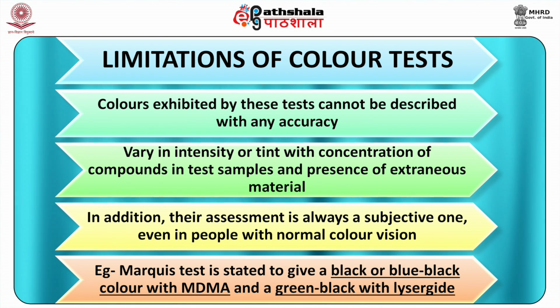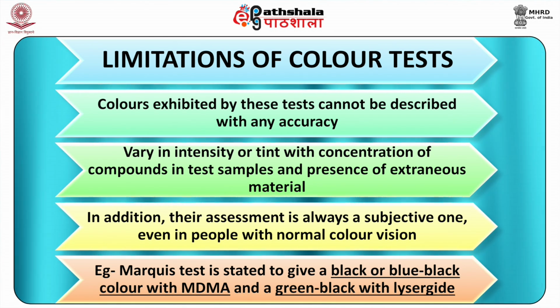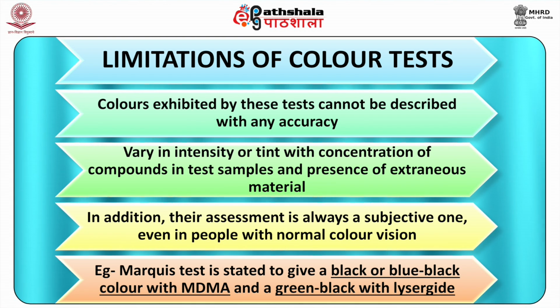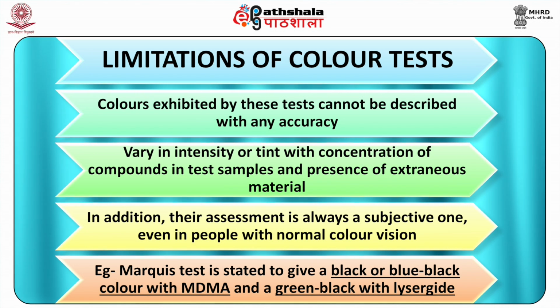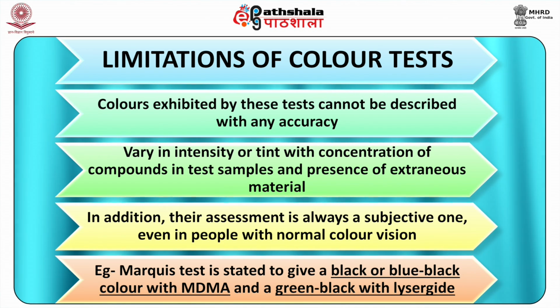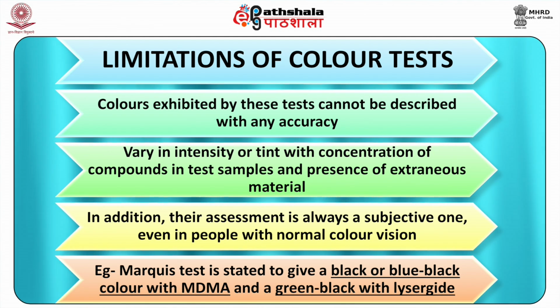In addition, their assessment is always a subjective one, even in people with normal color vision. For example, the Marquis test is stated to give a black or blue-black color with MDMA and a green-black with lysergide. Even in the pure form, these colors may not be readily distinguishable.